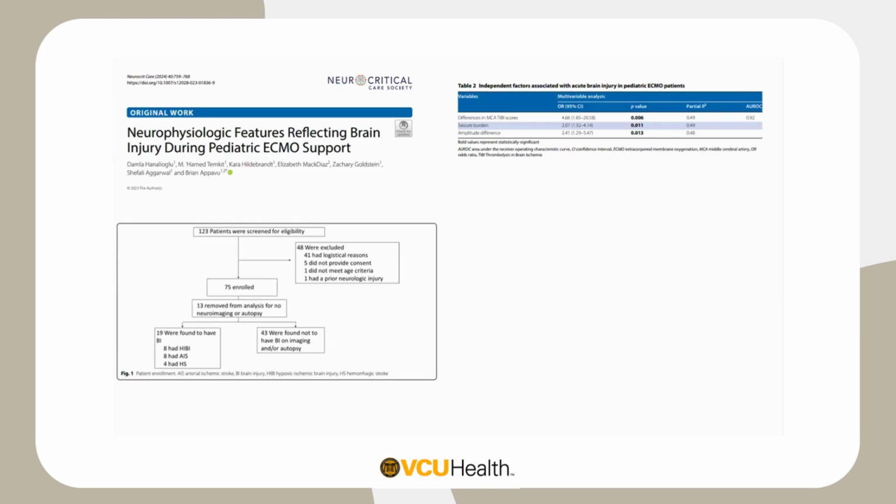However, the TIBI scores haven't been the focus of other pediatric studies because they come out of adult data. But if you do measure the TIBI scores for these patients, we found statistical significance with a pretty good p-value and a pretty high odds ratio, independent even when we accounted for markers from EEG and NIRS.